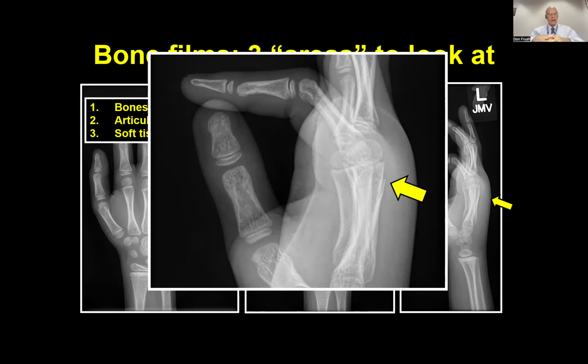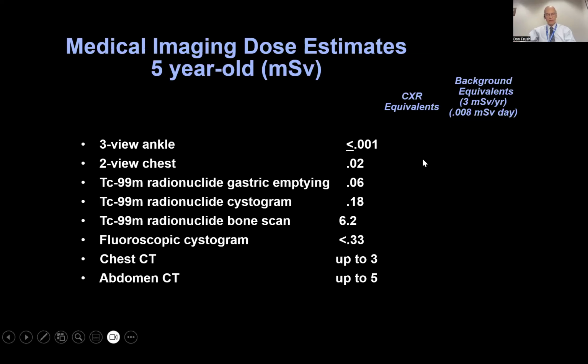And if you keep this in mind and embed that in your clinical practice, I think it's going to be helpful for you to understand what radiologists are looking for when they look at examinations, but also the times that you may be required to look at them, what kinds of things, and where the areas are to look at. So I'll move on now past the 5-4-3 rule, and we'll talk a little bit about some abnormalities.